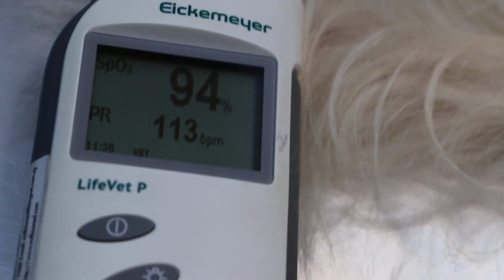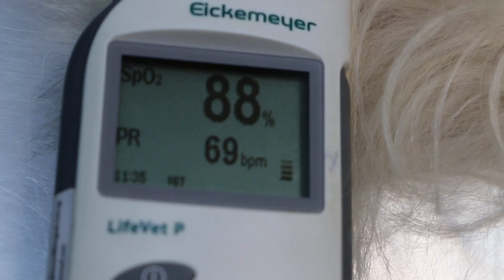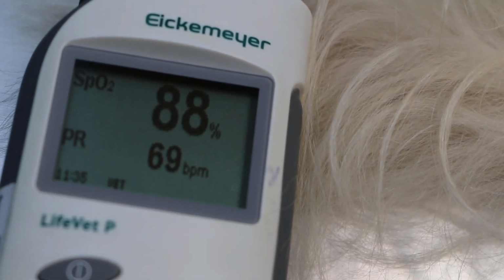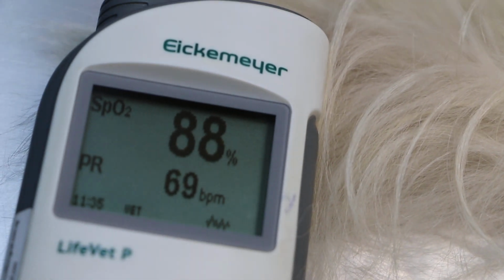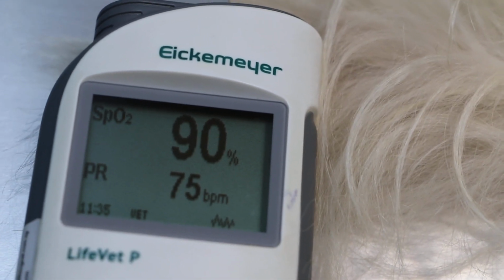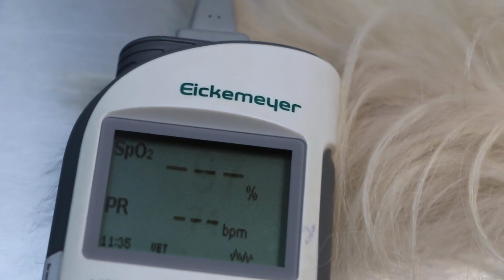94. Now it's starting to stabilize. Okay, stabilizing. We check the heart there. Heart rate okay? Yeah. But this one will show us, because the pulse rate is at 69. And SpO2 is 88%. 89%. 90 would be better. Yeah, 90. Okay, we finish the right hand side.